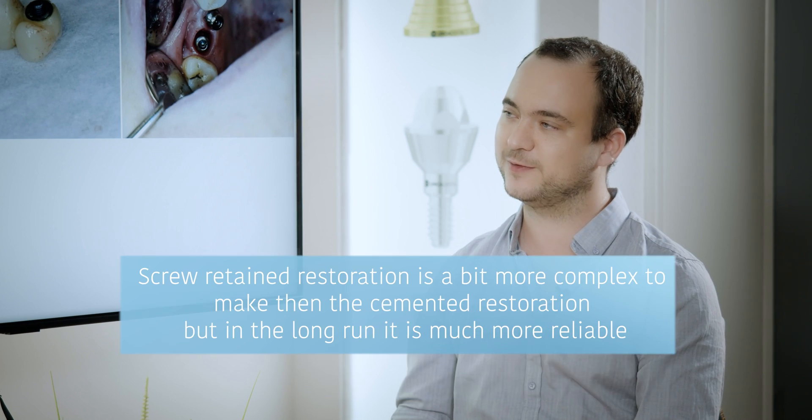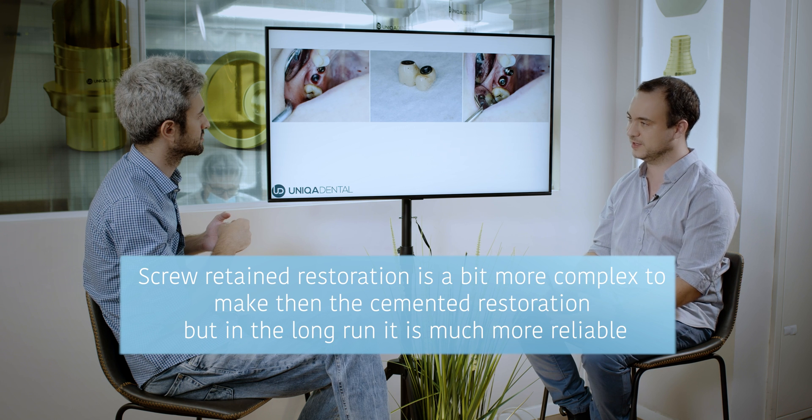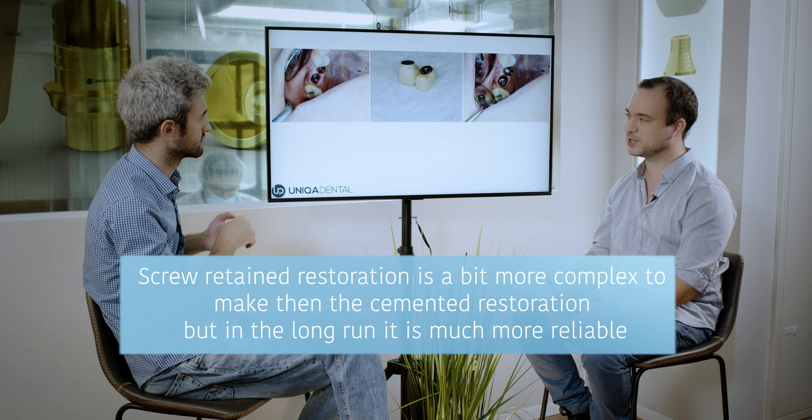On the other hand, if in the long run you have problems with the restoration and you made it well — with passive fit and everything correct — it's very easy to maintain, remove, and put back in. A lot of issues you don't have with screw retained restoration. It's probably a little harder to make in the first place, but in the long run it's a much more reliable restoration. That's why the world of dentistry is moving to screw retained restoration — you have better machines, better scanners, and the procedures themselves are becoming more and more precise.